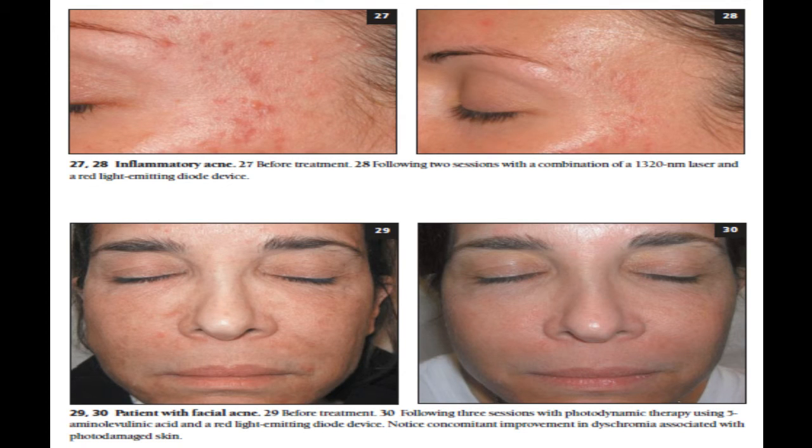While most patients tolerate the procedure very well with minimal to no discomfort, short-term adverse effects of PDT in the treatment of acne vulgaris may include mild to severe stinging, burning, or pain during the treatment, transient mild to severe erythema, edema, urticarial wheals, exfoliation, crusting, transient dyschromia, and acneiform pustular eruptions. Ice packs and mild topical steroids may improve localized symptomatology, while prolonged incubation times may cause more severe reactions, known as the PDT effect.